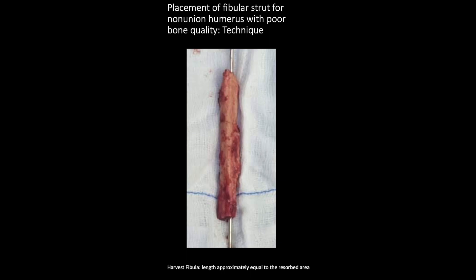First, you need to harvest the fibular graft. You can use your own technique, whether percutaneous or direct open technique for fibular graft harvesting. The length of the fibular strut you need should be approximately equal to the length of the resected segment of the shaft humerus non-union. You have to preserve the periosteal layer of the graft because it has osteogenic properties.